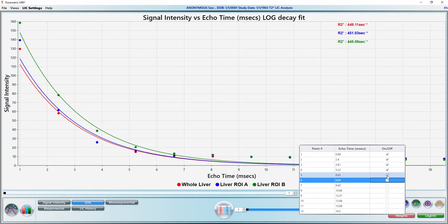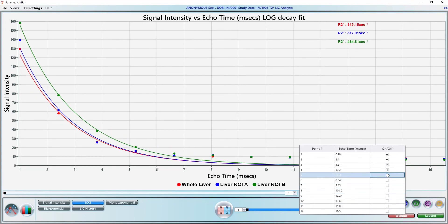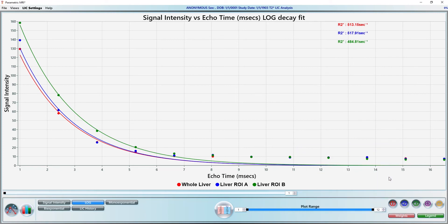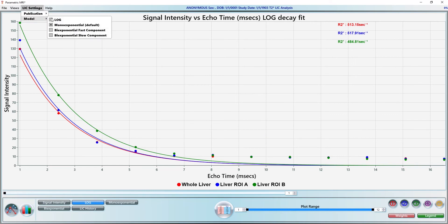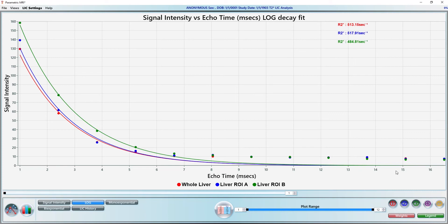If you decide to use the truncation model for LIC conversion, don't forget to switch to the log model in the LIC settings menu as well after adjusting the weights. For now, let's go back to the default non-weighted non-linear mono-exponential model.